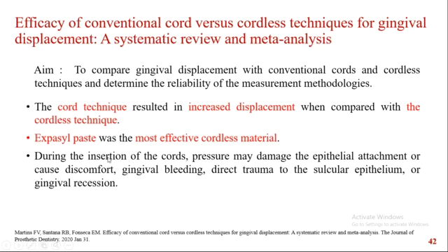However, during the insertion of the retraction cords, the pressure applied may damage the epithelial attachment, which can lead to gingival bleeding and direct trauma to the sulcular epithelium, which in turn can cause recession.